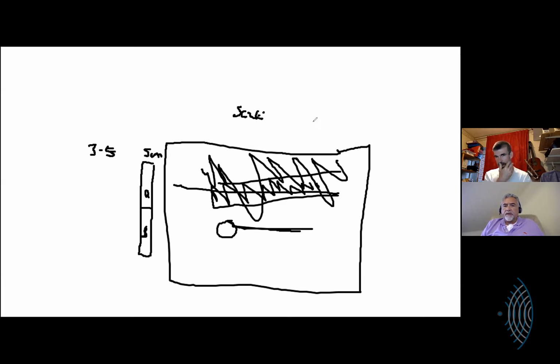And then one of the options highlighted on the system is described as scale. So that is the speed at which those items are flowing, and what you're saying is you bring it down to 3 to 5 centimeters per, I don't know, second or something like that. Yeah, I bring it down to those values. I would have to go back to my books to remember even what they do or what they're measuring, so I'm not going to bullshit you about it. But it is 20 years.